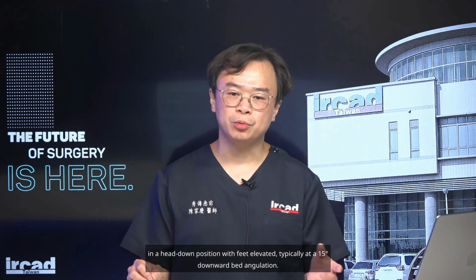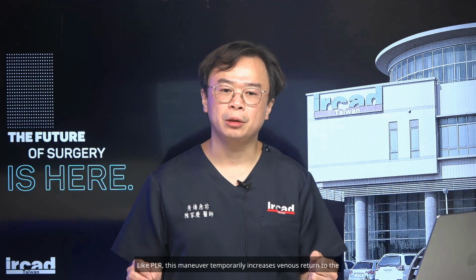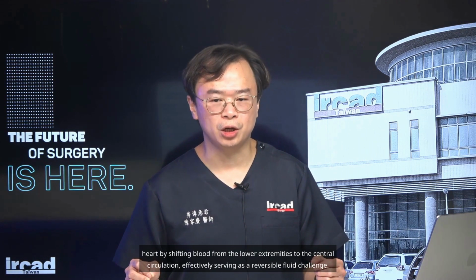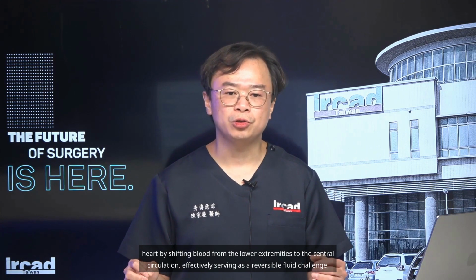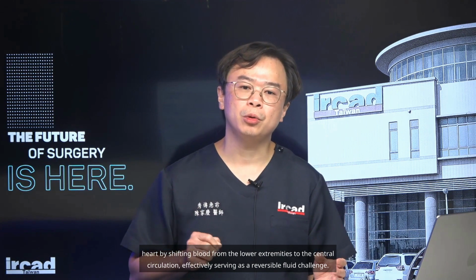The Trendelenburg maneuver. The Trendelenburg position, TP maneuver, involves placing the patient in a head-down position with feet elevated, typically at a 15-degree downward bed angulation. Like PLR, this maneuver temporarily increases venous return to the heart by shifting blood from the lower extremities to the central circulation, effectively serving as a reversible fluid challenge.